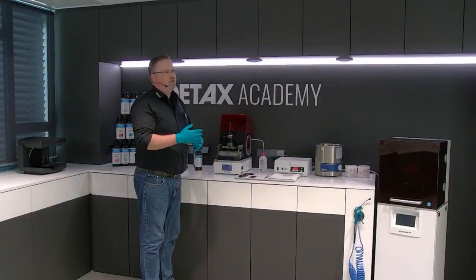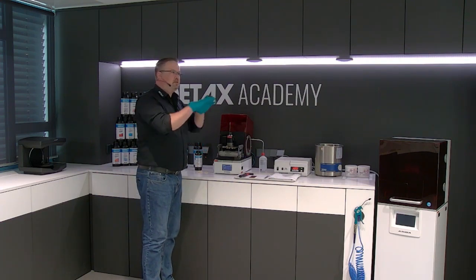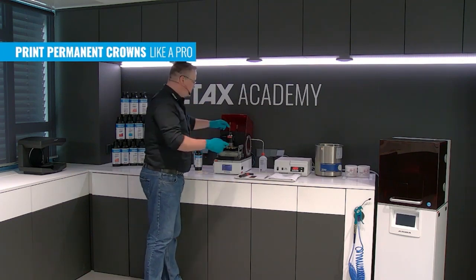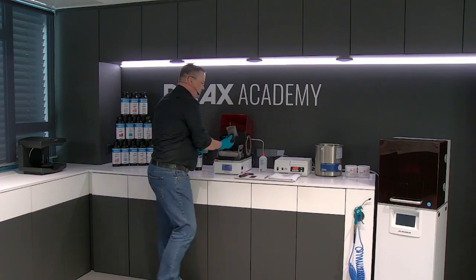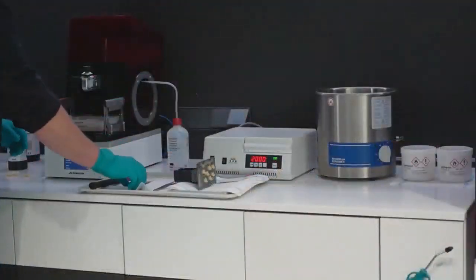Also, after the print job, please wait for 10 minutes until the rest of the material that is not needed goes back to the bottom or to the vat. It saves a lot of material and also a lot of money for you. For us, it's not so good, but for you, it's a benefit.